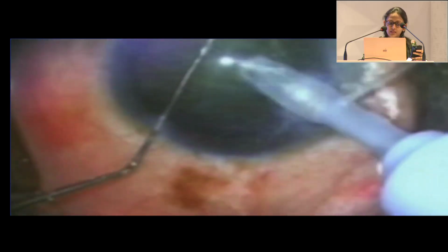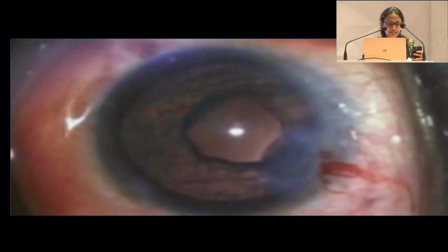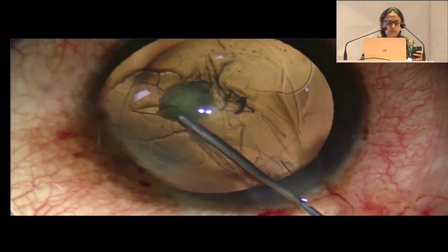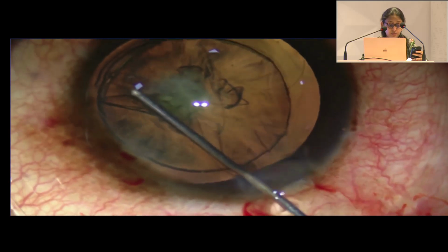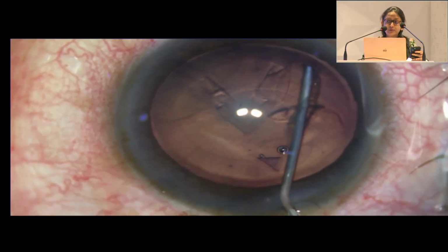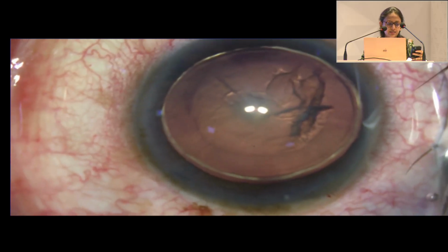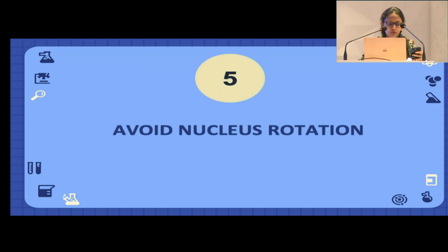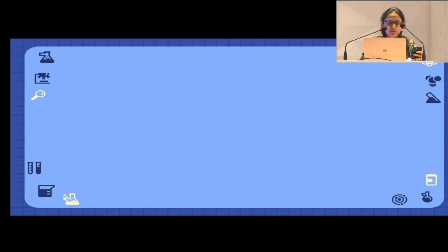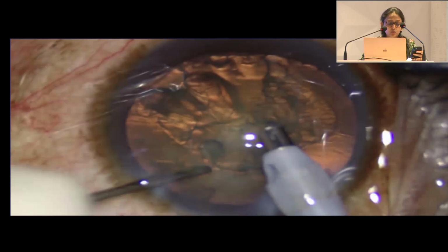So hydrodissection should be avoided as it may cause hydraulic rupture of the posterior capsule, leading to a nucleus drop. Only hydrodelineation should be considered because it creates a cushion of epinucleus and an endonucleus which is easily emulsifiable. It is performed by depressing the tip of the hydrocannula into the substance of the lens, and multiple injections of fluid are given in a controlled manner to hydrodelineate the nucleus, and we can see the characteristic golden ring sign which is obtained.